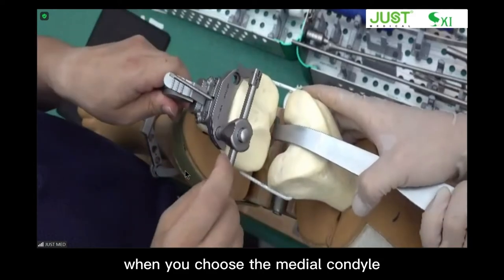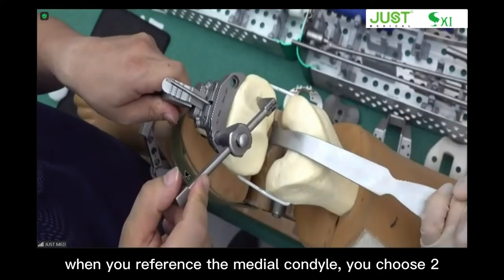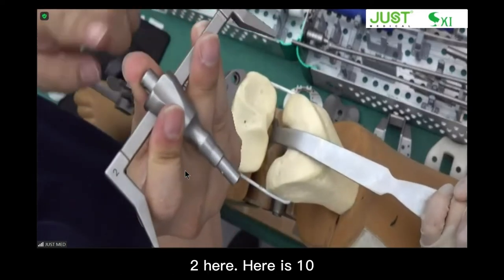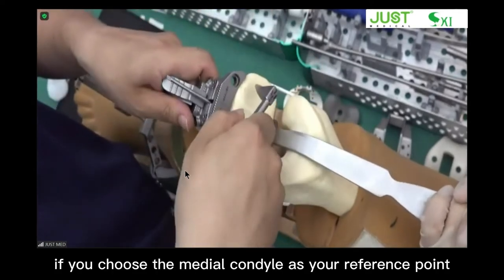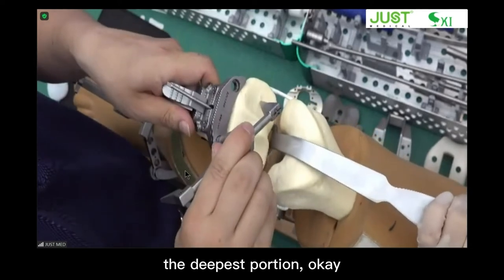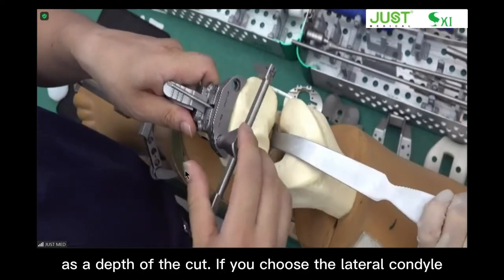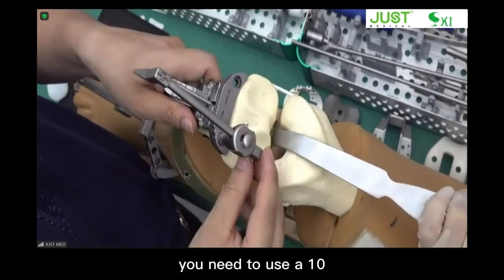When you reference the medial condyle, you choose 2. I can show you. Two, here. Here's 10. If you choose the medial condyle as your reference point, the deepest portion, you set the stylus at 2 millimeters as the depth of the cut. If you choose the lateral condyle, for example, you choose here, you need to use a 10.